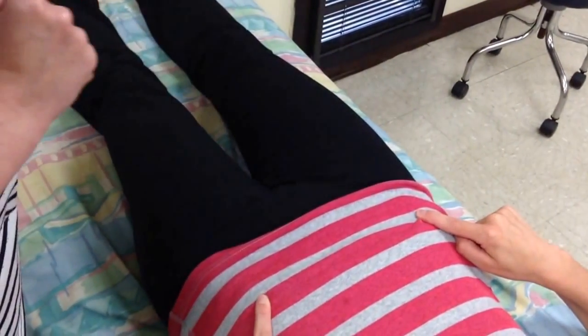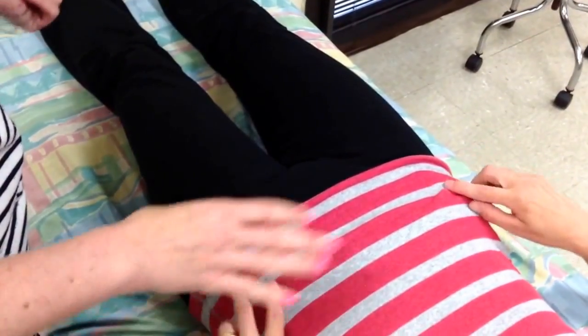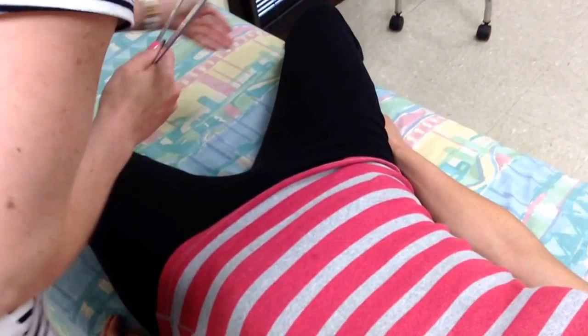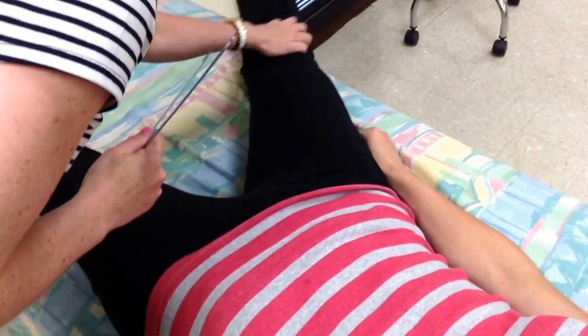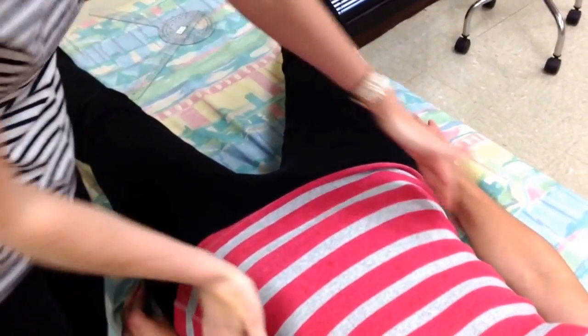Now we're going to do hip adduction. Suzanne, if you could just scoot toward me — you can always have your patient move along the bed. Then she can abduct the right hip out of the way so it doesn't impede her ability to move the left one. I might not have you bend your knee over the edge, only because I don't want there to be too much rotation in your pelvis.